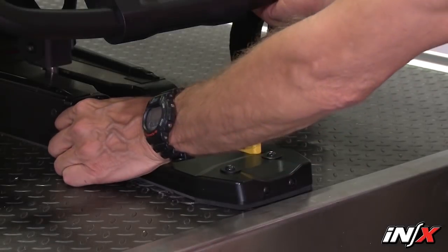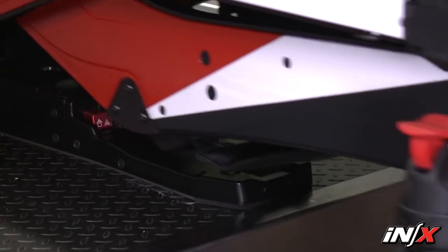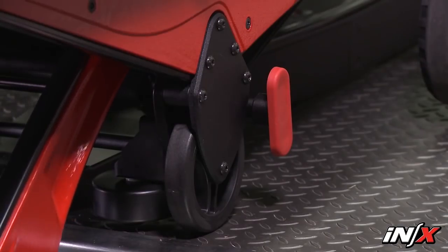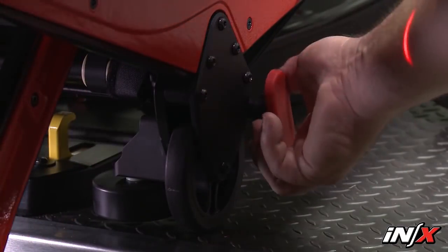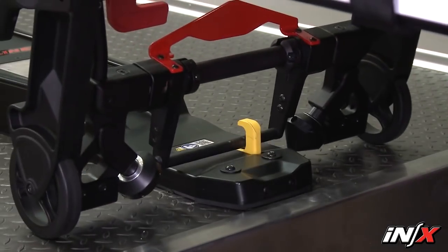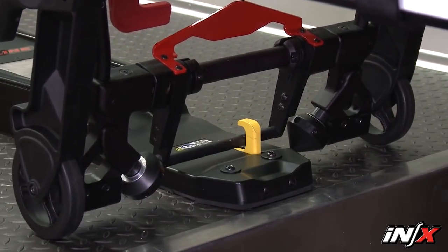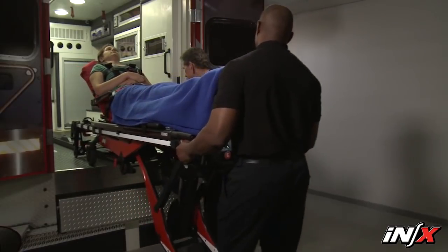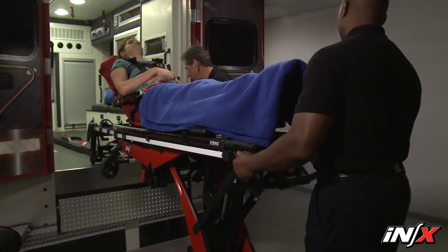Use the safety bar release levers to disengage each safety bar from the safety hook. A set of release levers is located on the loading end legs and on the telescoping frame. Release each safety bar from the safety hook by turning the lever counterclockwise. You'll use these levers when unloading the NX from an ambulance.